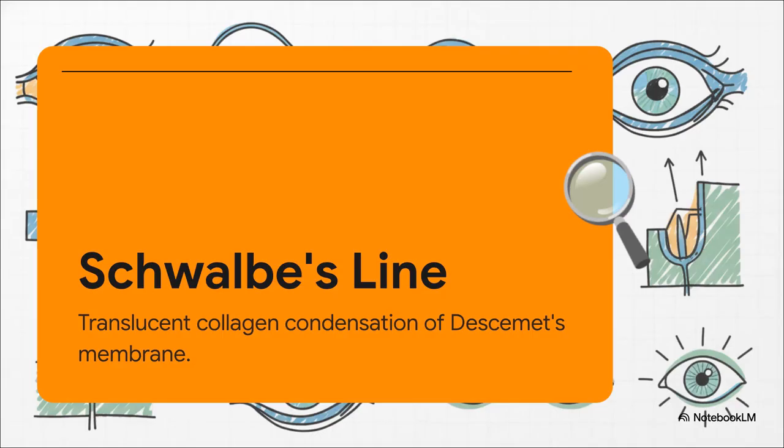Let's break these down, starting up front with Schwalbe's line. Clinically, this is described as a translucent collagen condensation of Descemet's membrane, sitting exactly between the trabecular meshwork and the corneal endothelium. But here is where you have to be super careful. Sometimes it's heavily pigmented. If a patient's iris is convex, a pigmented Schwalbe's line can easily trick you into thinking you're looking at the trabecular meshwork, so precision is key here.